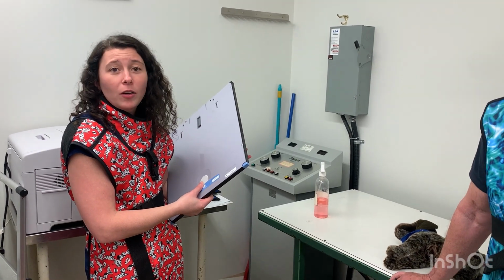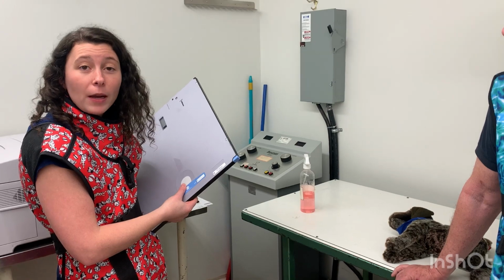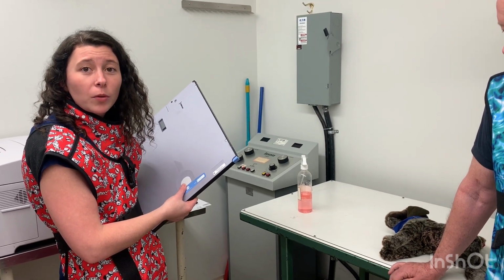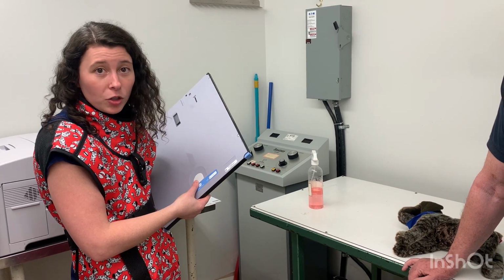Okay, hi, my name is Sam Kipp and my student number is T00698764. You're the clinical mentor, Dr. White. We're going to be taking abdominal x-rays here of our patient today. We're going to be taking two views. We're going to be taking a view from the right lateral position and a view from the ventral dorsal position.